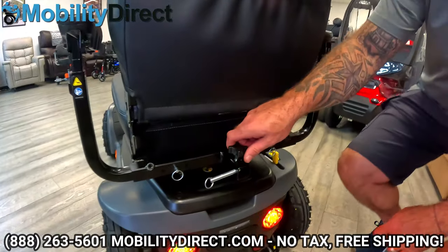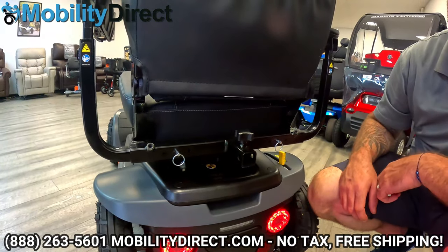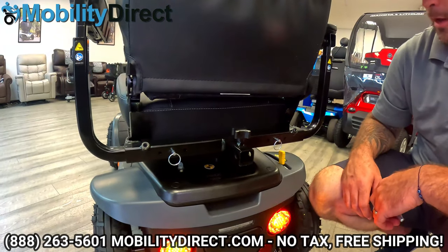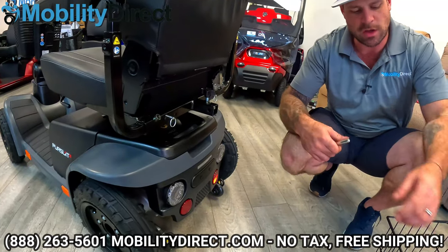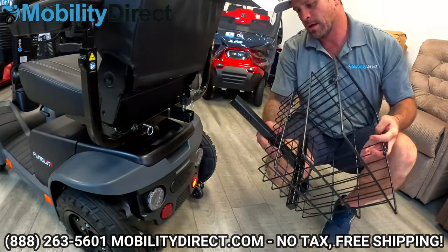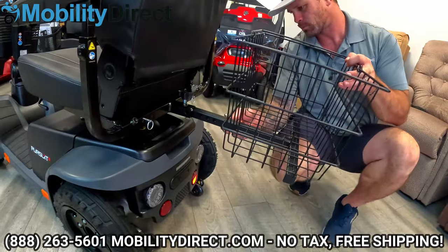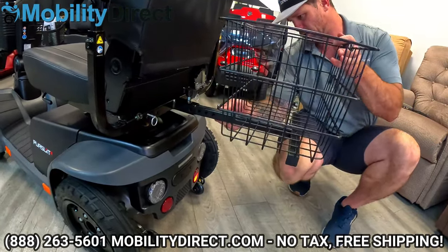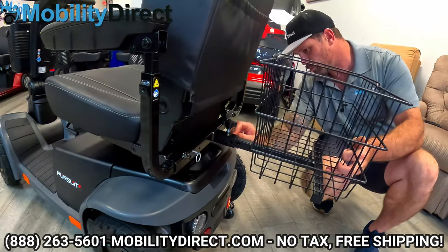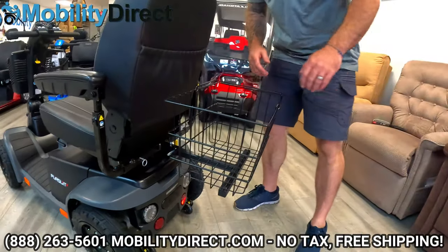On the back side of the scooter, we have an accessory port, so you can get a rear basket, walker holder, cane holder, fishing pole holder — there are multiple things you can put on here. Here is a rear basket — it's one of the most common accessories. It has a locking pin and a thumb knob. We're going to bring this in to the back of the scooter, put in our pin, tighten it up, and there you go — you've got your rear basket.